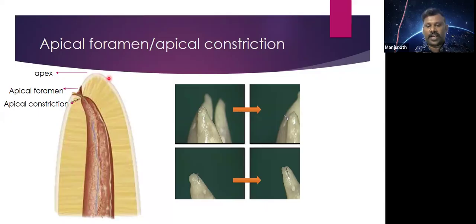So first thing you have to know that. So in this picture, I clearly explained that, see, the file is exiting somewhere away from the anatomical apex. So you need to know that never keep your radiographic apex as the terminal point of your root canal apex.